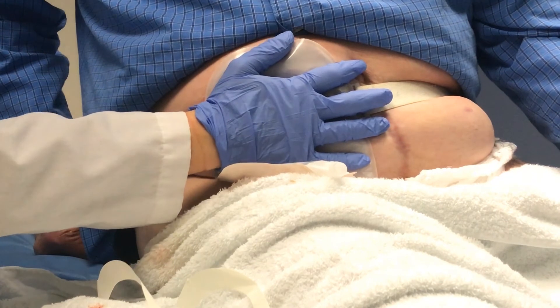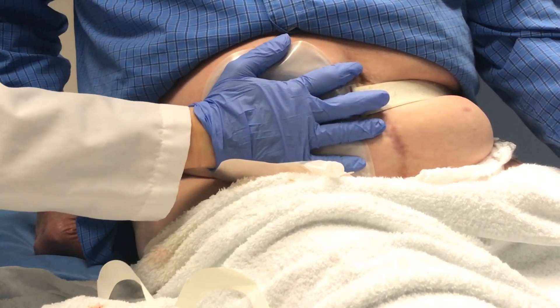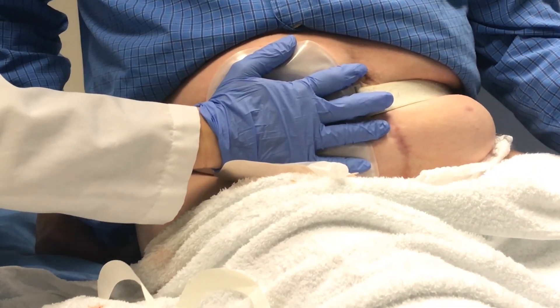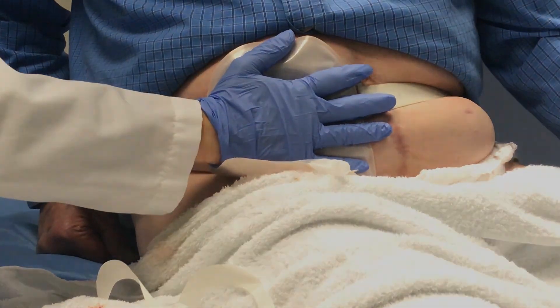We know it is scary now, but after a few pouch changes, you will be surprised at how confident you will be when completing your pouch change. Initially they may take 45 minutes in the hospital, but after some practice, you should be able to complete a change within five to fifteen minutes. Thank you.